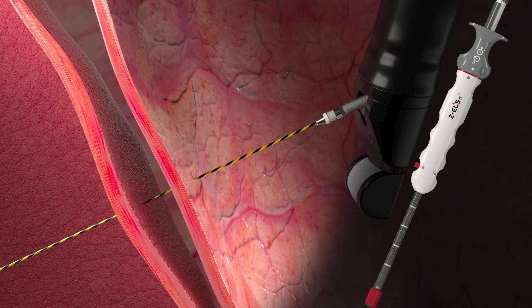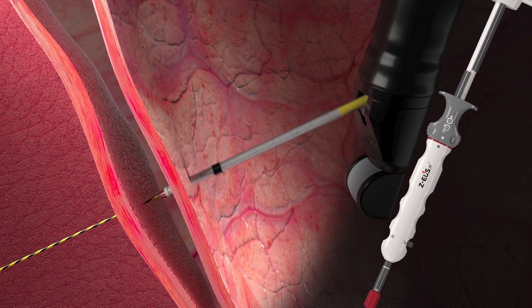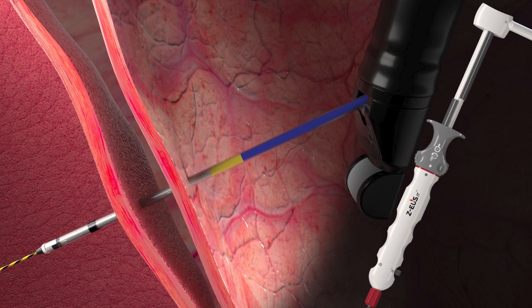Step 1: Positioning. Unlock the sheath lock and push the sheath handle to the targeted location. Make sure the generator is on the recommended setting — pure cut — and push the sheath handle downwards under EUS guidance. Stop the sheath handle at the proper position. When entry is completed, lock the sheath lock and power off the generator. Then unplug the cable from ZEUS.